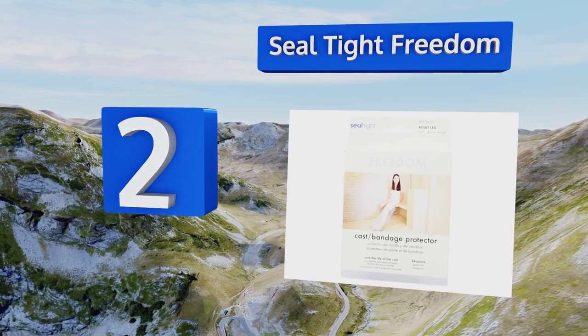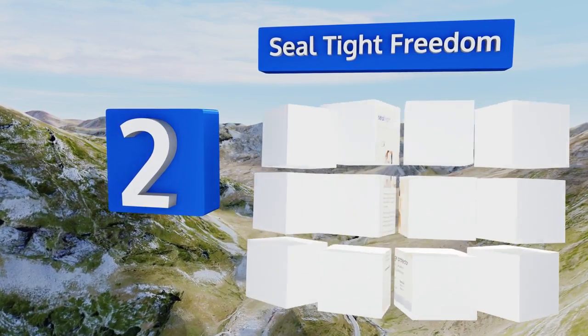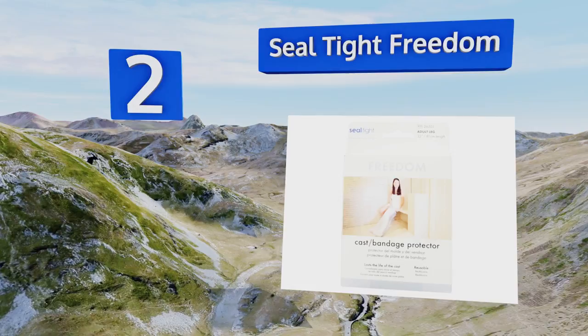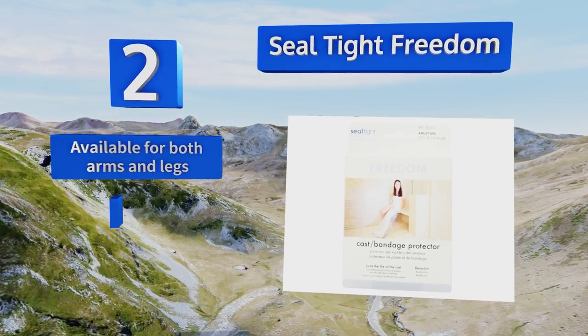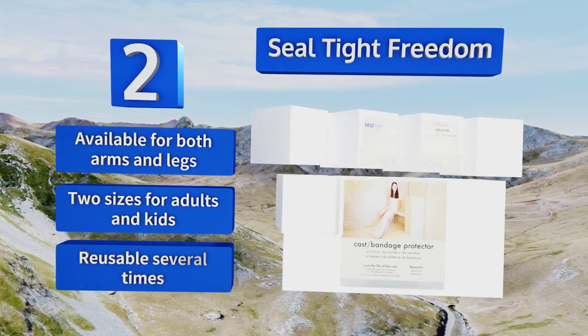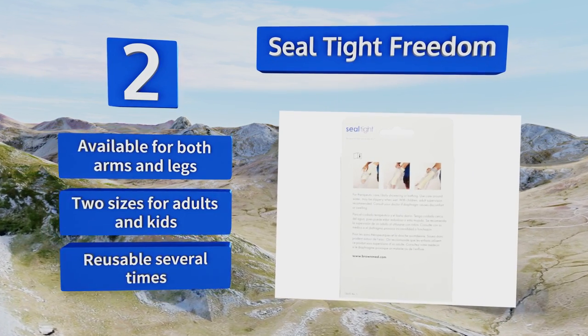At number two, the Seal Tight Freedom is made of a thick vinyl material, which lets you know right away that it's serious about keeping water out. The tight seal might be slightly uncomfortable for some, but that's a small price to pay to stay dry. It's available for both arms and legs and in two sizes for adults and kids, and it's reusable several times.